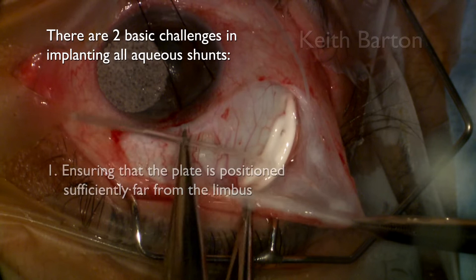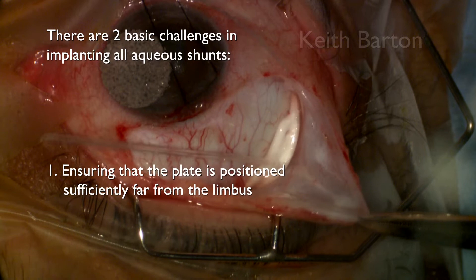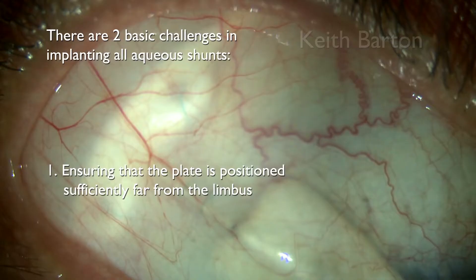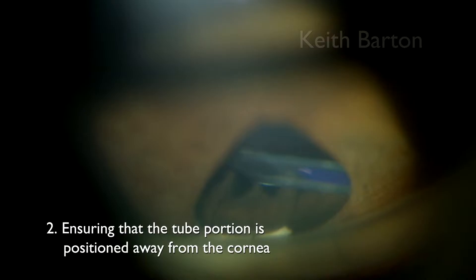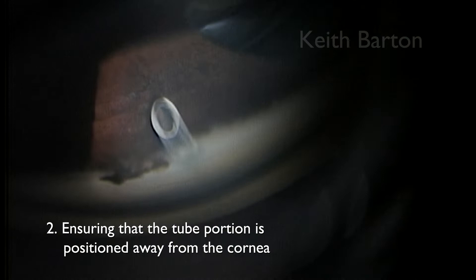There are two basic challenges in implanting all aqueous shunts. Firstly, ensuring that the plate is positioned sufficiently far from the limbus. Secondly, ensuring that the tube portion is positioned away from the cornea.